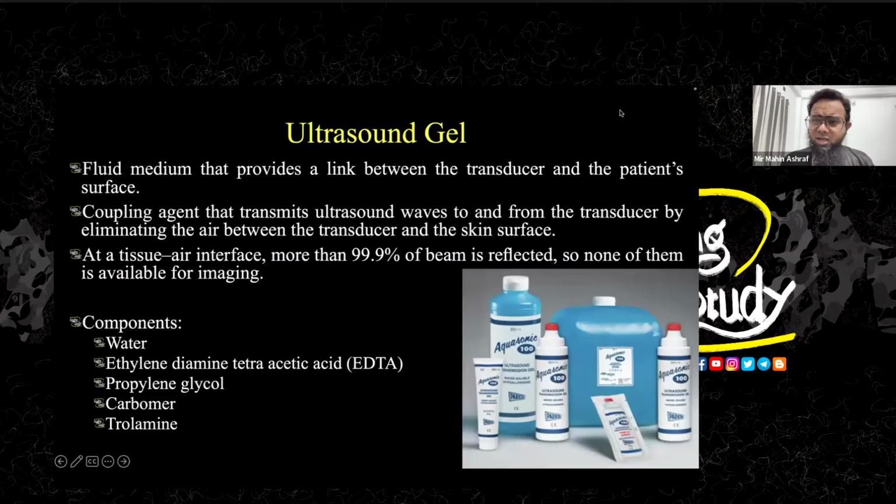Okay, anyway, come to the ultrasound gel. We use gel a lot, okay? So this is a fluid media we use and it's quite like a semi-solid substance, I think. So this gel is composed of water actually. Most of the part is water and there is EDTA and something else. So it's quite safe. It doesn't actually irritate the skin surface, and the main reason to use the ultrasound gel is to prevent the air.